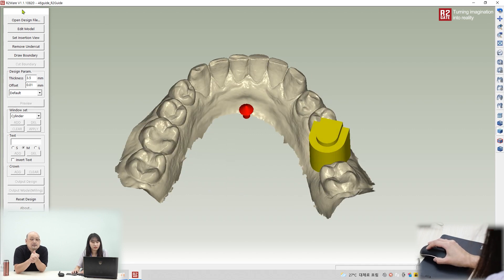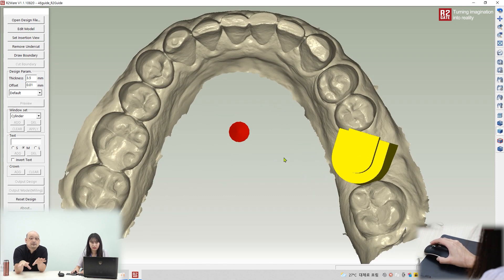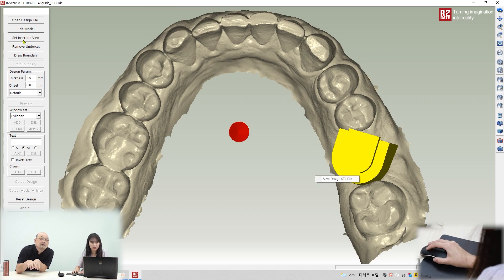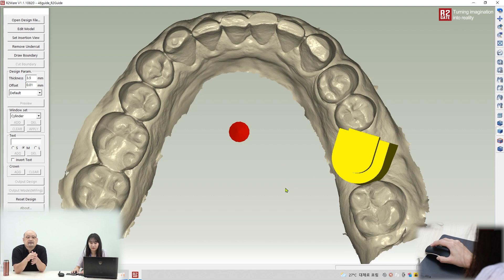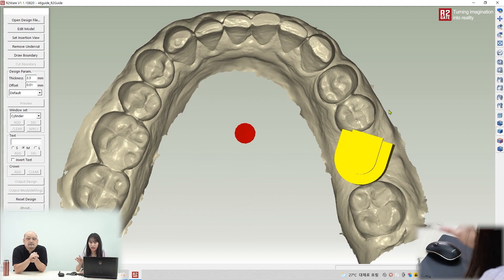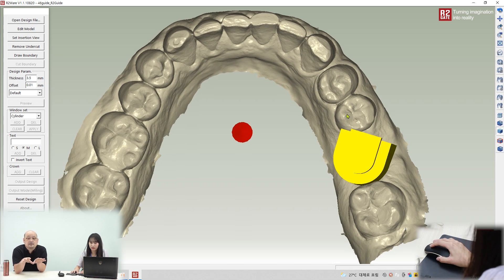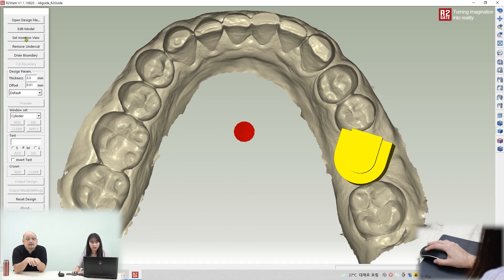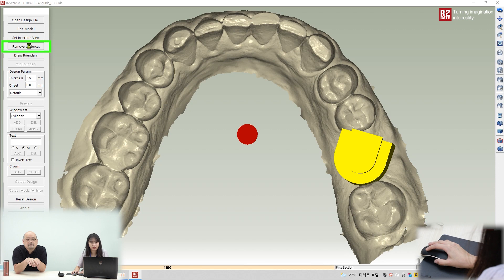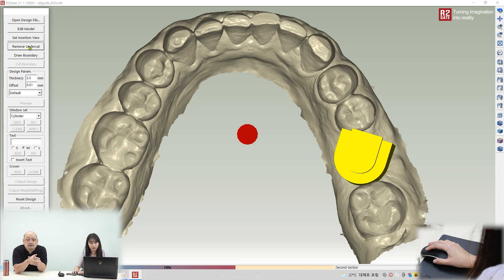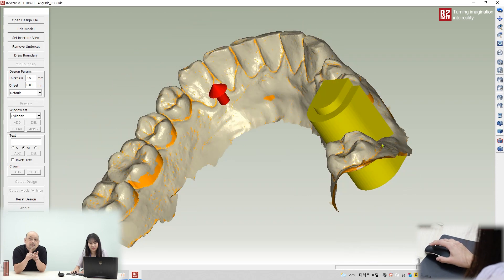The first thing is to set the insertion path — yes, it's the insertion path. Set up the path and then remove the undercut. Click, and the software will remove the undercut. Okay, finished — you can see the result.